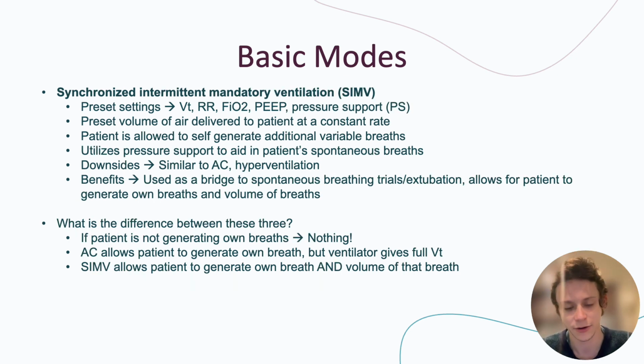Next, we have synchronized intermittent mandatory ventilation, also called SIMV. Just like the previous two, once again, we have tidal volume set, respiration rate, FiO2, PEEP set. However, this time we actually get a new preset setting called pressure support, which I'll go over in a second. So just like the previous two as well, we have a preset volume of air delivered to the patient at a constant rate. The patient is allowed to self-generate spontaneous breaths.